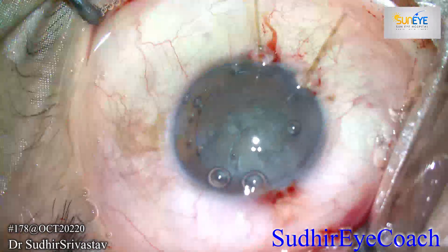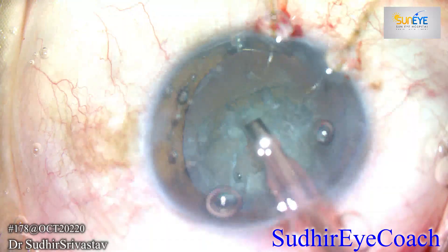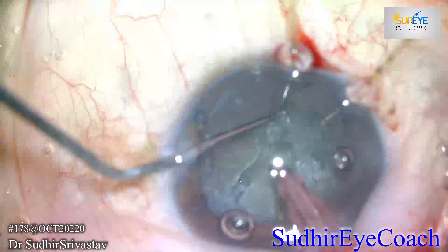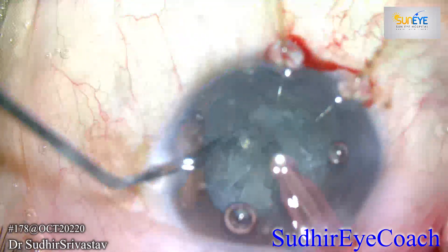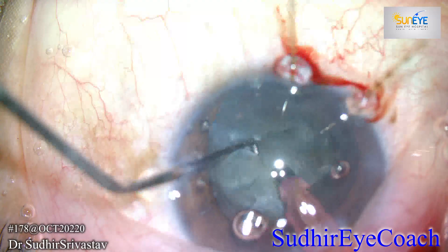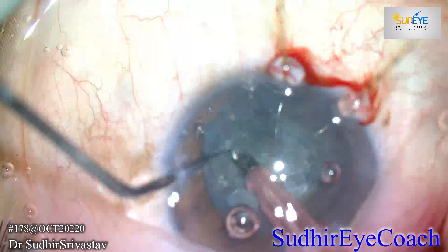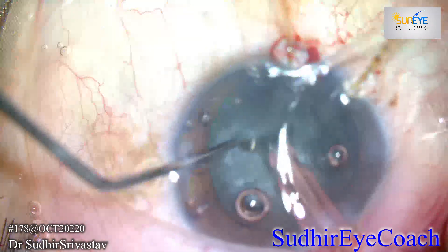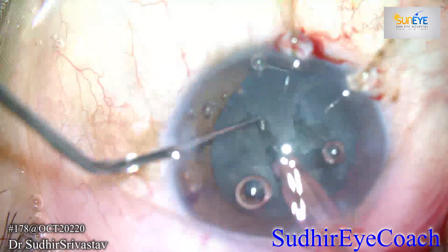I noticed that chemosis had started occurring at the area of the main corneal incision. If chemosis increases, your surgery will become difficult because visualization becomes a great problem when bogginess is very high. Making a small chemosis nick and a central pinning maneuver adjacent to the entry can reduce the chances of further development of chemosis.